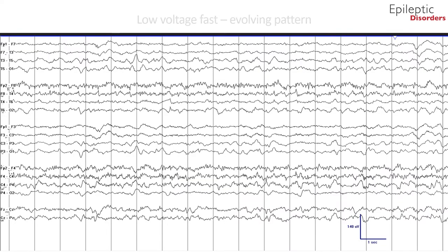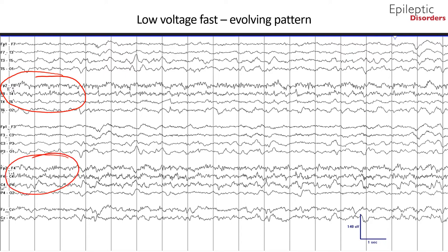In the second page of the seizure shown in bipolar montage, you can see in the beginning of the epoch over the right frontal region the same evolving pattern of low-voltage fast frequency activity. In the fourth second of the page, outlined by the green circle, are well-defined phase reversals and epileptiform discharges, which initially in the epoch occur as quasi-periodic discharges.